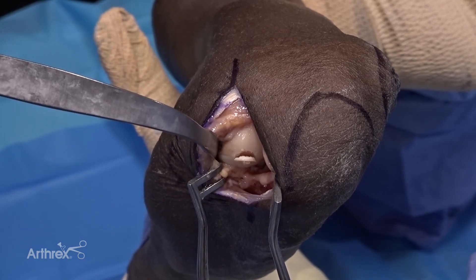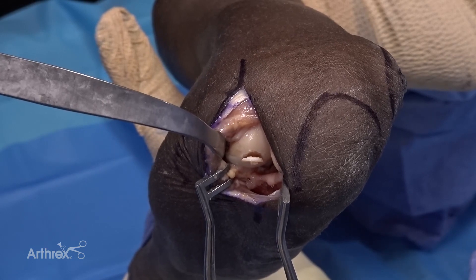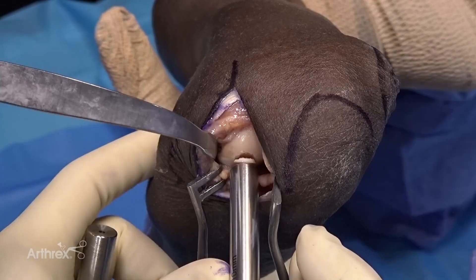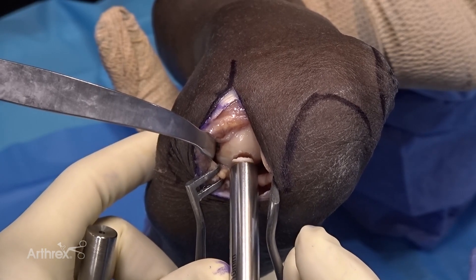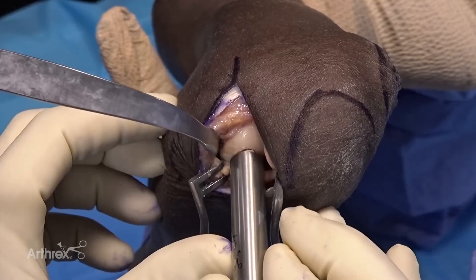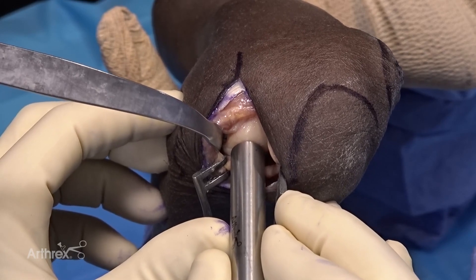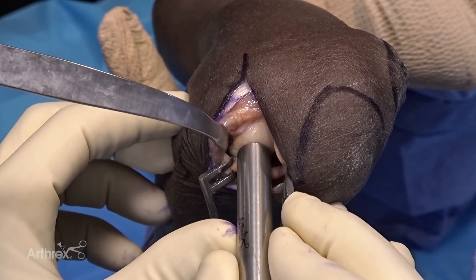We'll next begin with assessing the size of graft that is needed. This can also be estimated accurately from the preoperative MRI. First a 10 millimeter sizer can be used, but it seems to be a bit undersized given the size of the lesion. Moving up to the 12 millimeter sizer, this seems to provide adequate coverage to span entirely the OCD to normal chondral borders. Based on this, we're going to implant a 12 millimeter fresh osteochondral allograft.